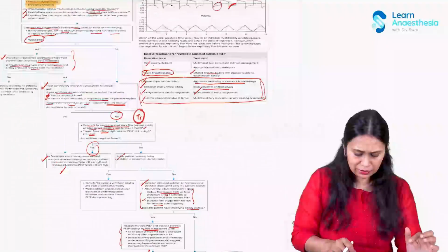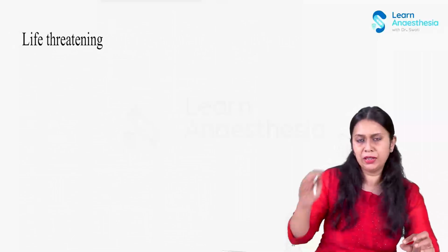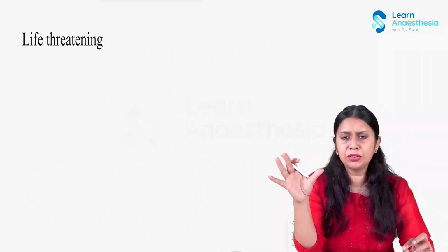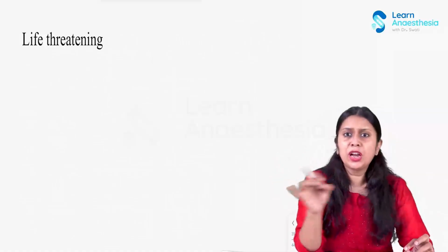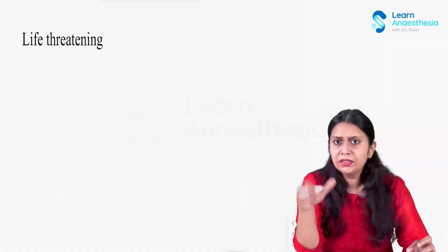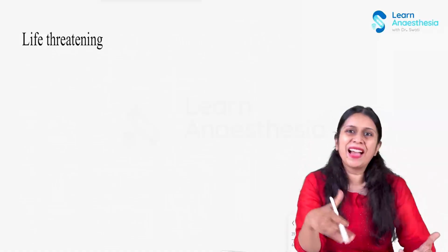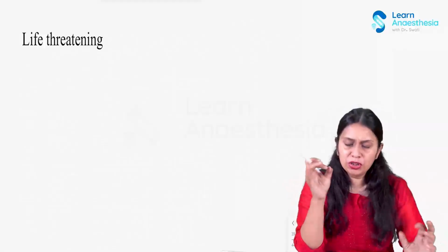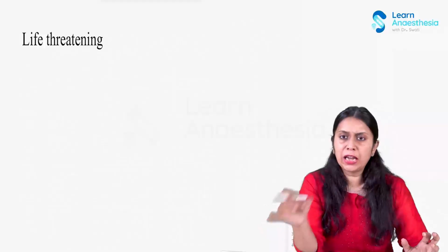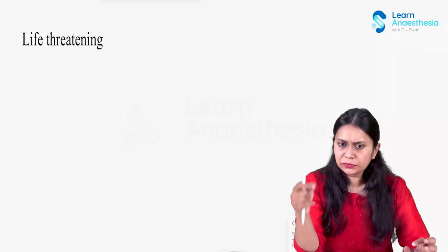So I will again discuss all the steps which I discussed. If it is life-threatening, it is suspected in an intubated patient with very high pressure being generated and very rapid shallow breathing, high minute ventilation, low tidal volume, increased respiratory rate, and very high pressure. All this in a background of COPD especially, we should think about intrinsic PEEP, dynamic hyperinflation being developed. So if it is being developed, what should we do?